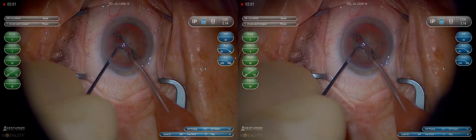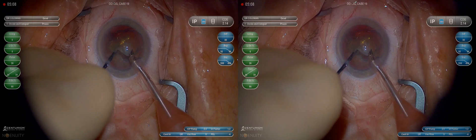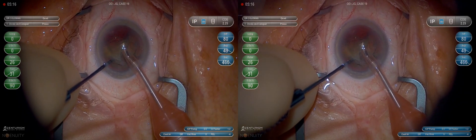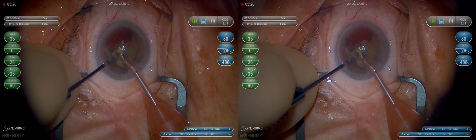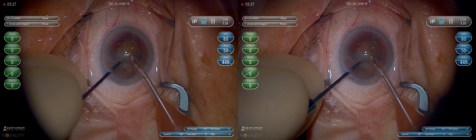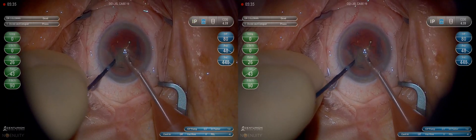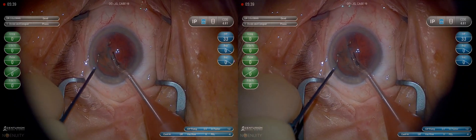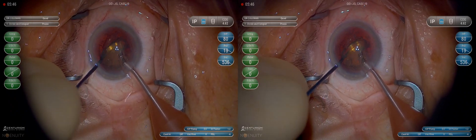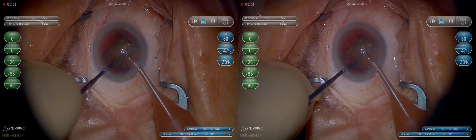The key to the crack is getting the chopper positioned deep down into the groove. The chopper should be slightly more posterior than the phaco tip. I'm going to lift the hemi-nucleus up and make sure that I crack off a complete quarter. We don't want to take an eighth or a sixth because the other piece will be too big and it will be difficult to raise into the anterior chamber. We'll bring the other quarter up — remembering now that the hemi-nucleus still present in the bag is holding the posterior capsule back, making our risk of touching the posterior capsule low at this point. We want to crack as much of a perfect quarter as possible — not a sixth or an eighth, a pure quarter if possible. That's the most efficient way to get the nucleus out.